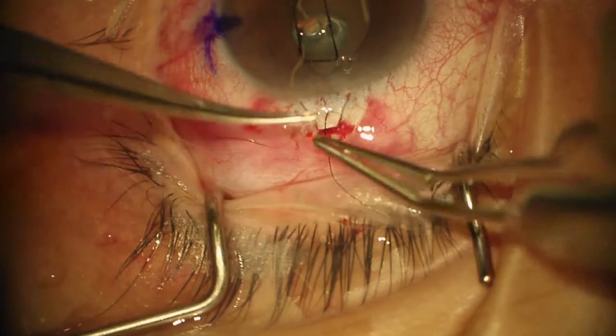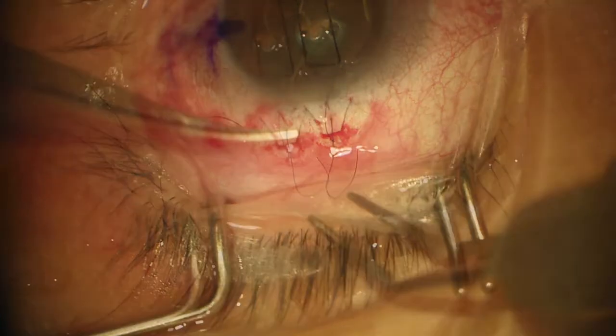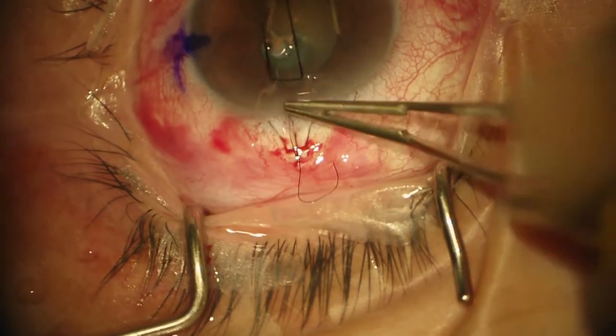Reform the chamber and make sure my iris goes back in. Good. We can sort of encourage the iris to come back in. A little bit of BSS, please.